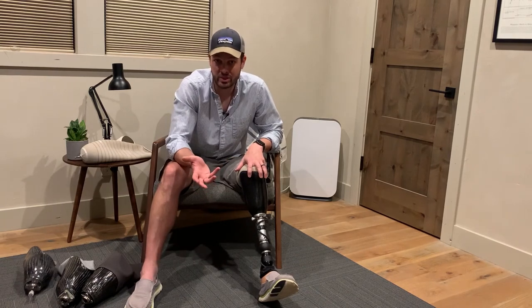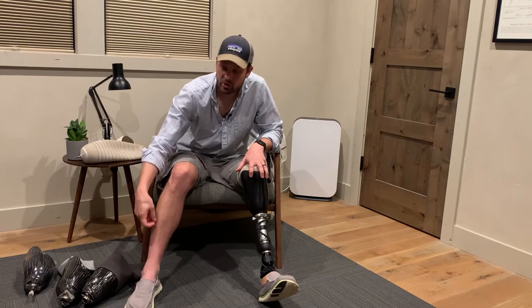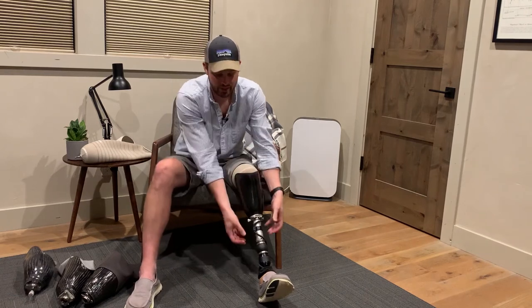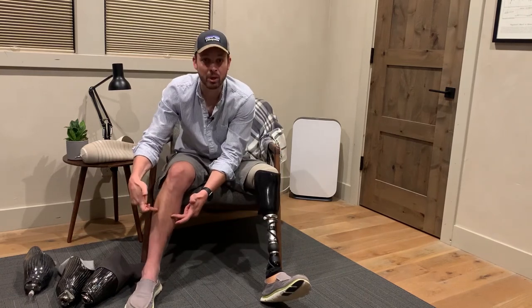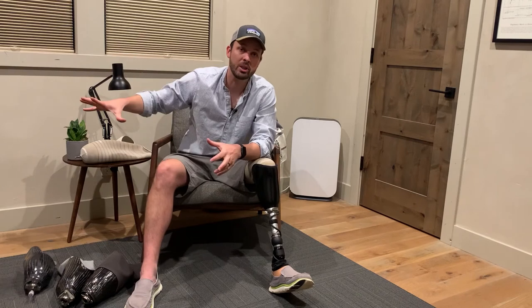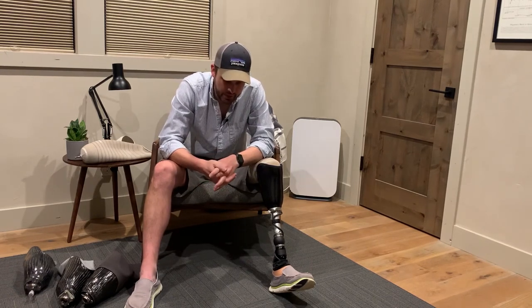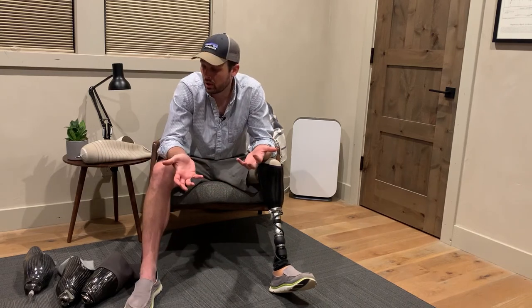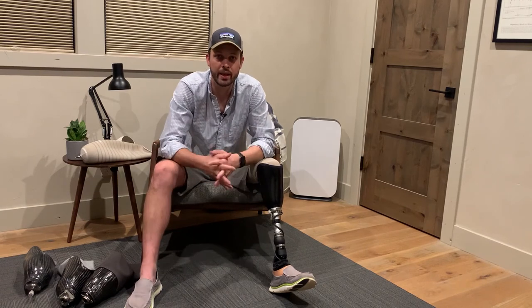Finally, there's osseointegration, where a metal rod is surgically implanted into your bone. You then don't need sleeves, liners, or sockets because your foot attaches directly to your body. It's really convenient once you're through the surgery and recovery, but it's more challenging because it's lower impact — you don't want to do anything really heavy duty on it because it can snap and break a bone.